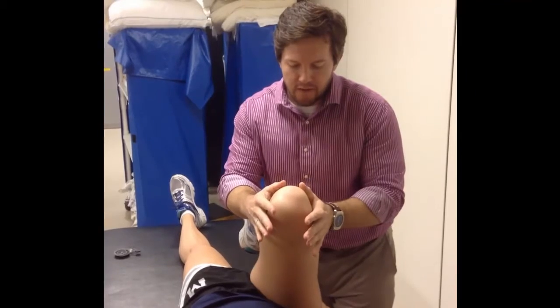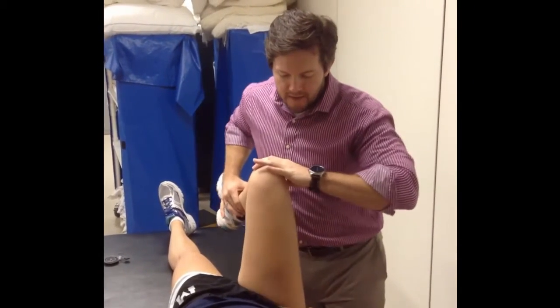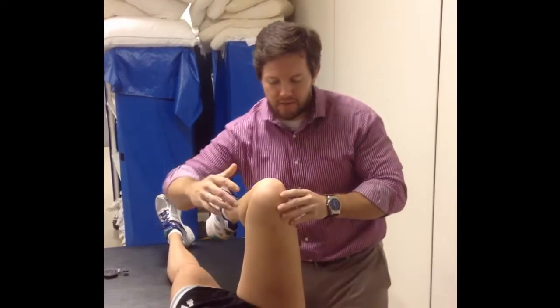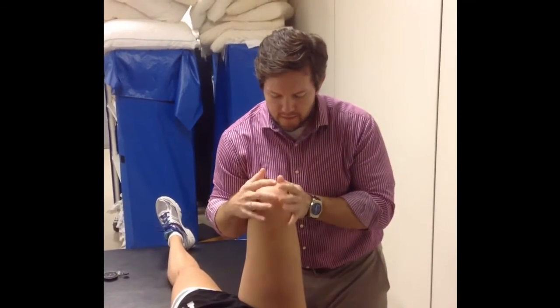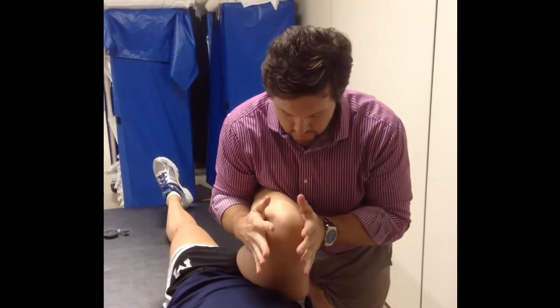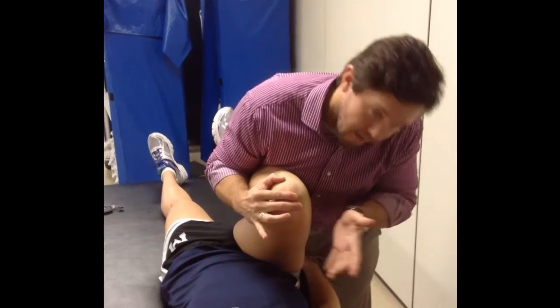The other thing to keep in mind is another cheat will be a little bit of external rotation. As the leg comes up, it will want to start to externally rotate to gain some more motion while still maintaining that straight line into flexion. So if you just cup around the lower leg a little bit, that'll help you watch out for and block that external rotation. I still have my bubble inclinometer here and I can look at the measurement from there.